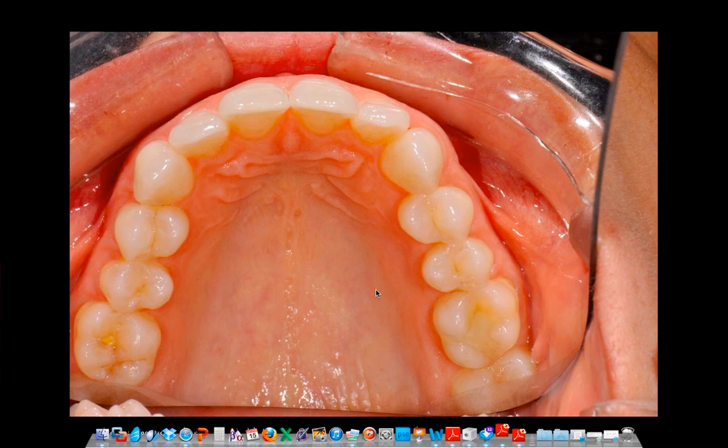Here's another one, off center, fogged. Not a terrible image, but if I was going to grade this, I'd call this a B minus, C plus. The second molar on the patient's upper right is not visible. The linguals really aren't that visible. Be intellectually honest. Don't look at this and say, well, it's good enough for me.